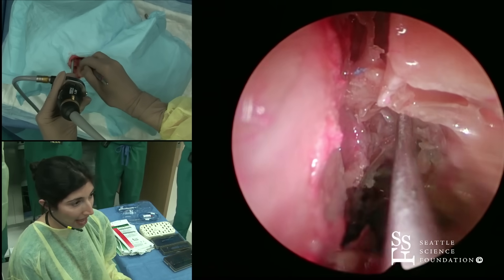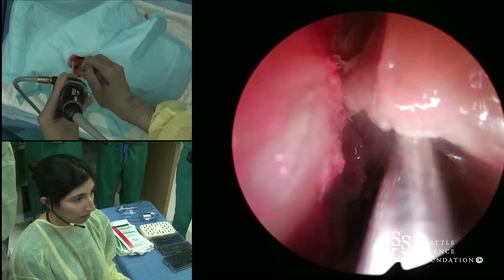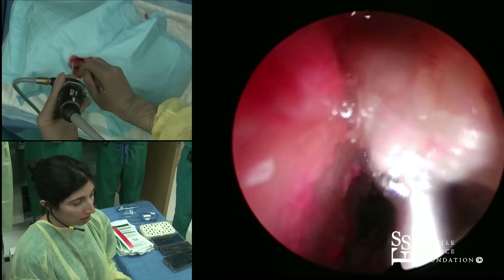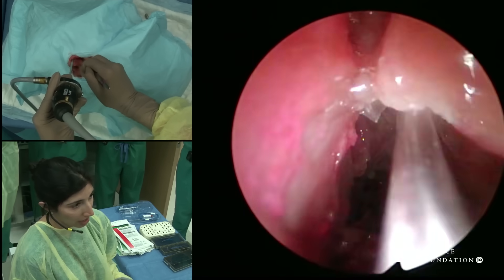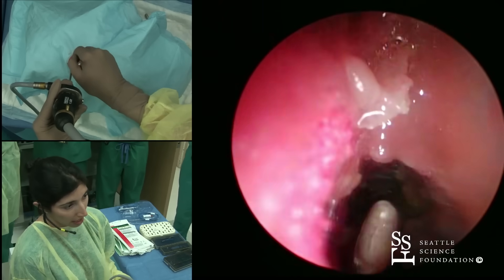Now that we have that out, I'm using a frontal curette to just sort of bring this forward. We don't want to take too long — let you guys have some dissection time. I'm just going to move all this forward and then we're going to take it with our debrider.